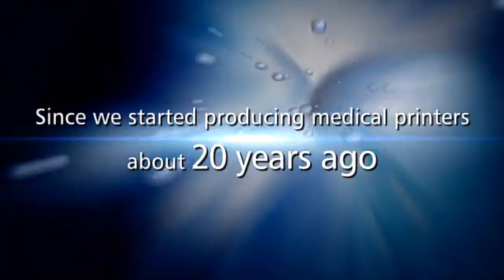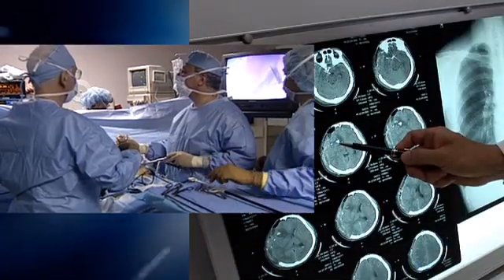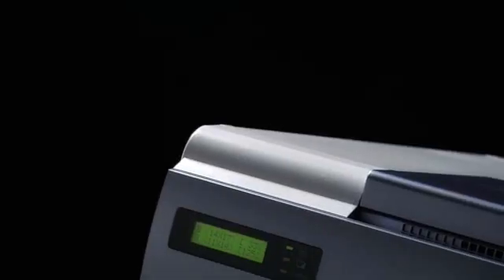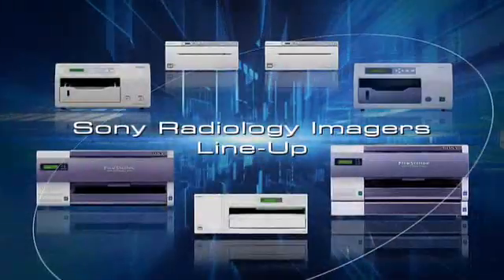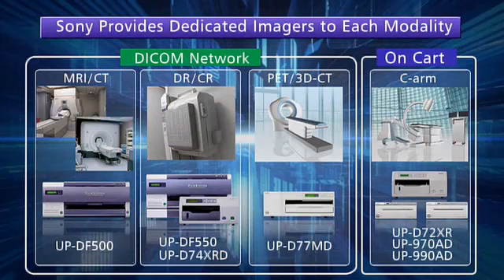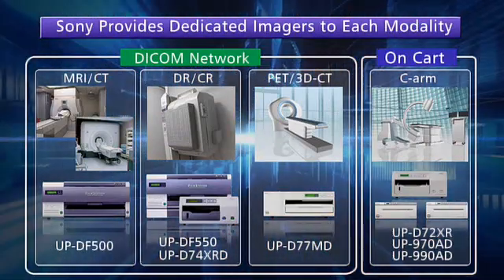Since Sony started producing medical printers about 20 years ago, they have become widely accepted in the fields of ultrasound and endoscopy and are utilized by many doctors worldwide. Based on the technology and customer trust developed in those fields, Sony is now continuing work into radiology with a line of printers specialized for different radiology modalities, equipped with dedicated features that support the individual characteristics of each modality.